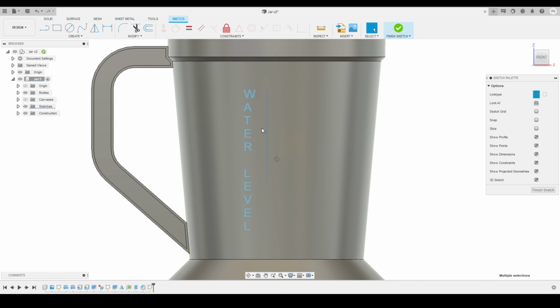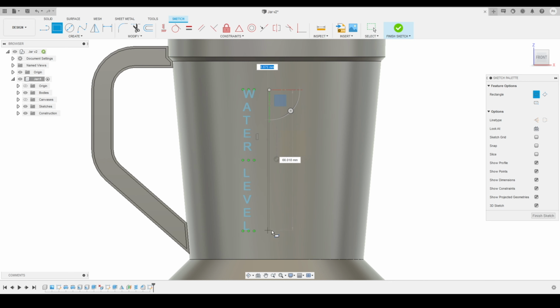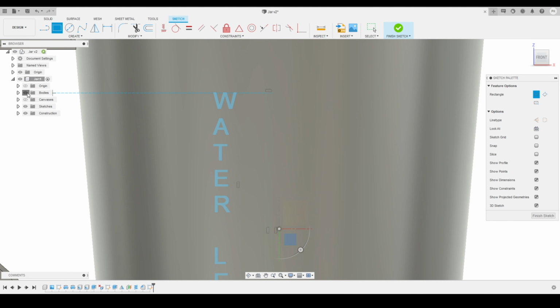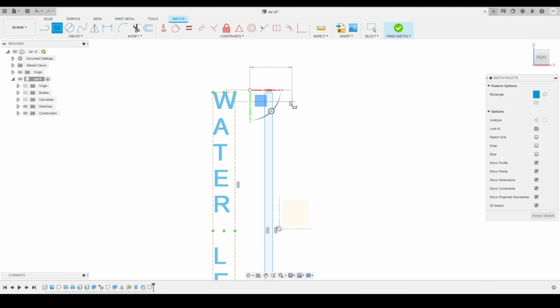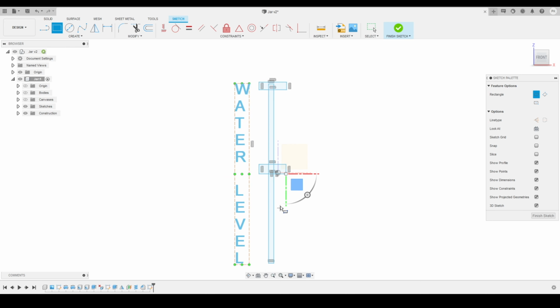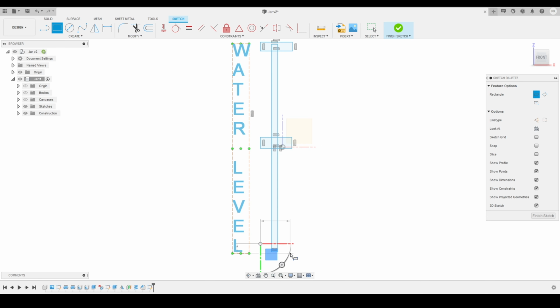Now I will adjust the text box around the text. Here you can see I will make sure that it is completely covering our text, and we'll make sure that the text is horizontal. So I select the text box side and apply the constraint. Now I will activate the rectangle tool, and we'll create a rectangle like this. I'm trying to make a shape of the label, which we can do using multiple rectangles. So I will turn off the bodies for now, and I will start creating multiple rectangles like this. Here you can see, these are the three labels I'm trying to create: one for the start label, then for the maximum label, and then for the intermediate label.